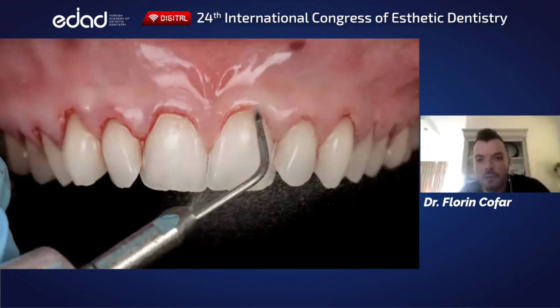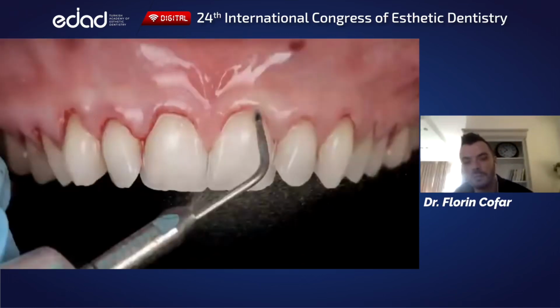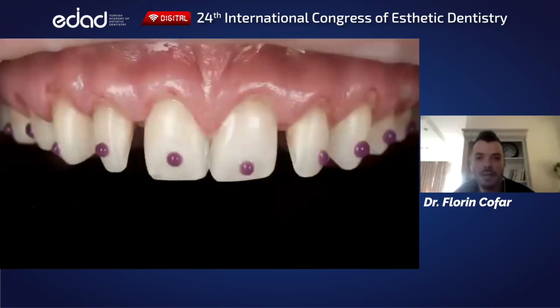My focus after that is just to put the tissue according to this mockup. As you see on all these mockups, the bisacryl is on top of tissue, so I have to recontour the tissue according to those measurements, and then do the preps. Whenever we do flapless, we usually do it at the same time as the surgery.